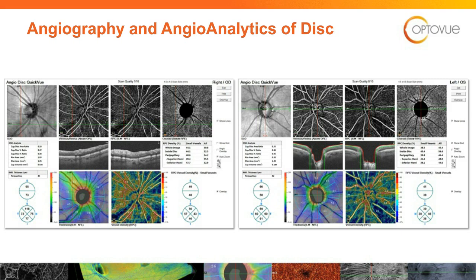But what's more exciting is if you go to the radial peripapillary capillary and the vessel density map, look at that little wedge that's dropped out. You can see how that just matches the wedge defects that we see in the nerve fiber layer. If you keep going over, these numbers are the percentages. 49 and 48 is superior and inferior, but you can see down there in that inferior quadrant how it's a little compromised from that little wedge defect. Now remember, that's the right eye. The left eye is worse.